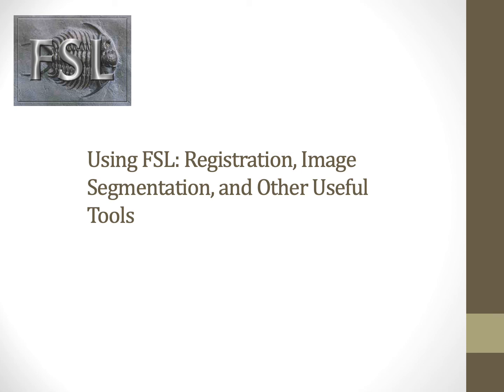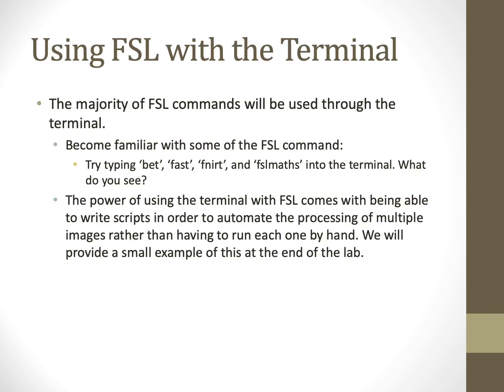So let's begin using FSL for image registration, image segmentation, and other useful tools. We will be using FSL primarily from the terminal. The majority of these commands can be called from the terminal, and you will become familiar with their use from the terminal. One nice feature that FSL offers is that if you simply type a command into the terminal and press enter, you will see a list of different options that become available when using that specific tool.